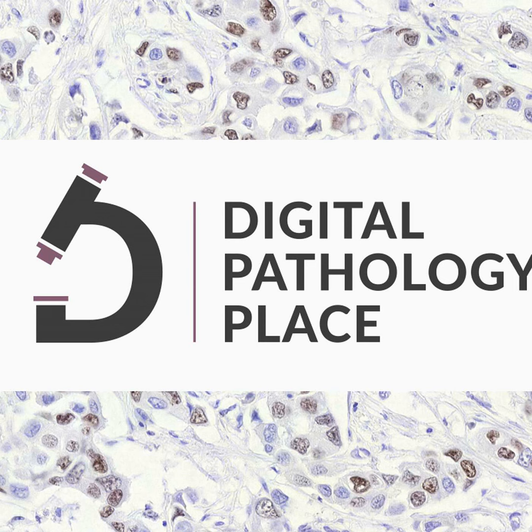So let's say, for example, we have a project where the university hospital here in Liège will provide the slides, but the computational part will be taken by a university, for example, MIT. They can work in the same platform because it's server side, and the computational developers can do their work within Python using the Python library, and the pathologists can open the web front end whenever they want, from wherever they want, at home or during a congress or whatever, to see the image, to annotate, to make the review, and so on. So yes, it's a main advantage to be web-based. You can work from everywhere.